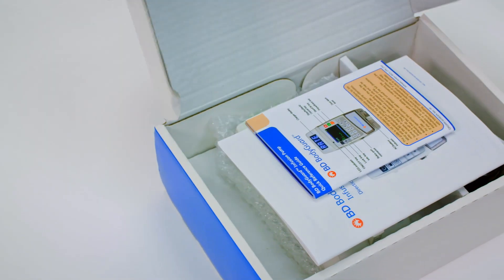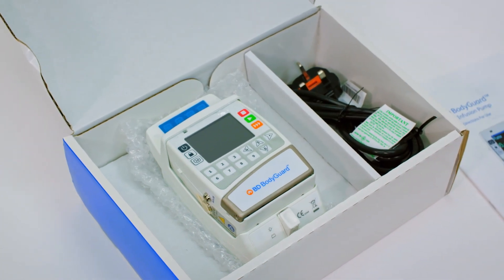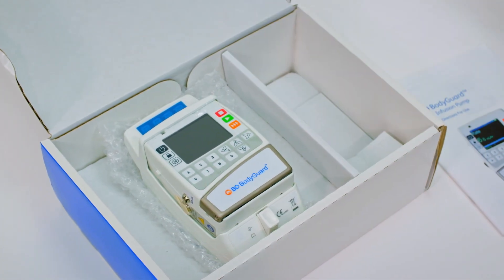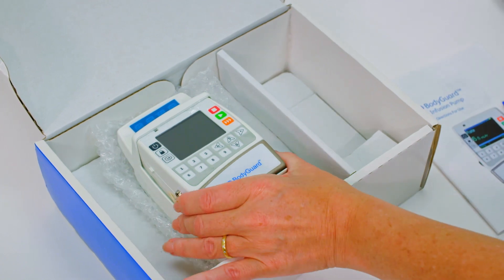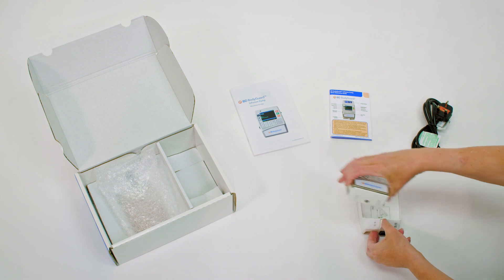Your BD Bodyguard Infusion Pump Kit will include a pump power charger with power cord, rechargeable battery pack, as well as a quick reference guide and directions for use. It is important that you keep all of this in a safe place.